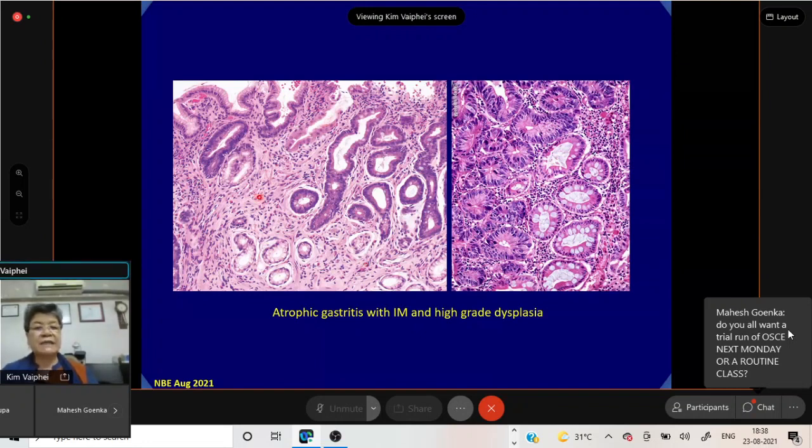So whenever one is having this kind of atrophic changes, in addition to the metaplastic epithelium, one also all the time has to look for dysplastic changes in the same biopsy. And so if one is suspecting, this is slightly blue staining, but this will be because of the regenerative atypia, but the changes in this particular focus are quite different.